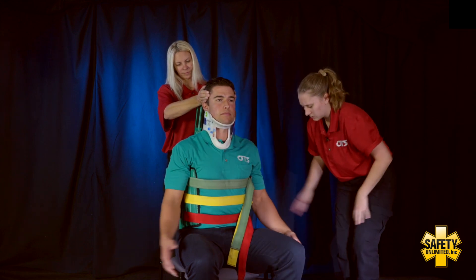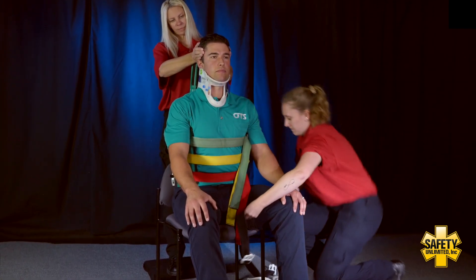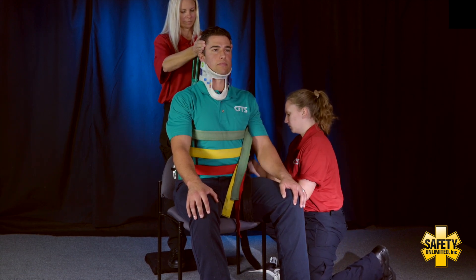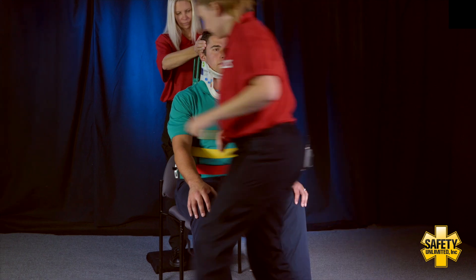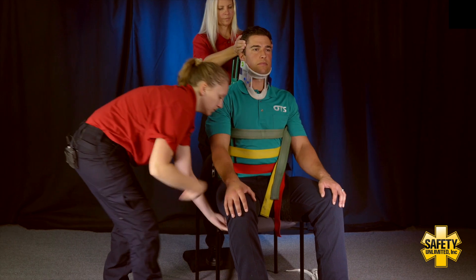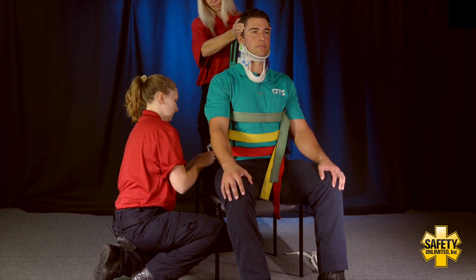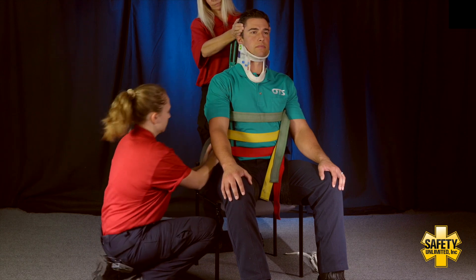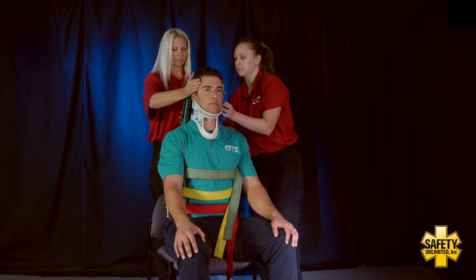You can go ahead and relax your arms. We're going to go ahead and do the leg straps. Now that we have those leg straps secured, before we go ahead and secure the neck, I'm going to pad any voids necessary.